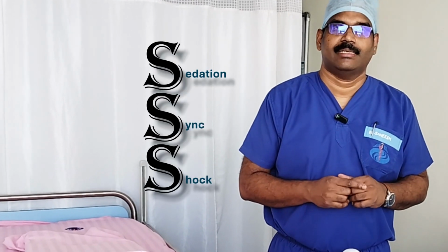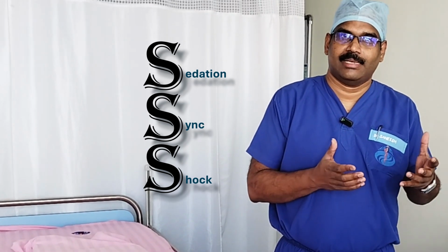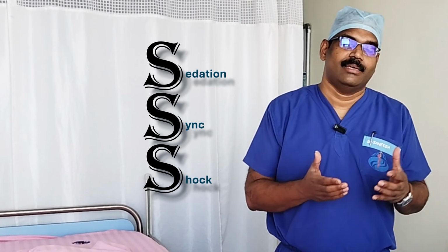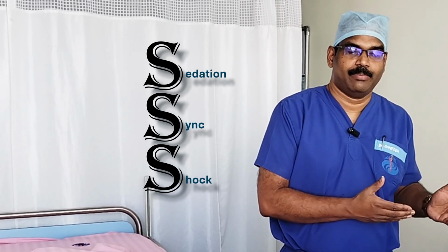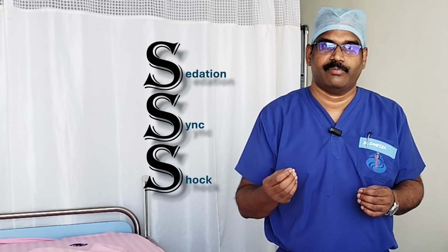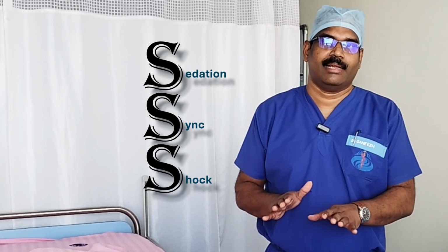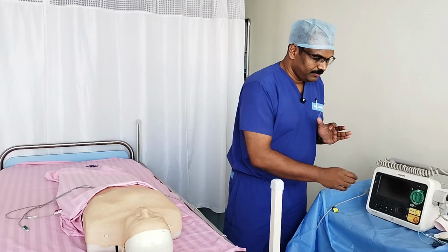Now we go to 3 S's. First is sedation. This is a slightly painful procedure. It's an uncomfortable procedure for the patient. So you can consider a sedation with say benzodiazepine or a narcotic or a small dose of propofol or thiopentone, whichever is available depending on the clinical scenario. Second S is sync button.